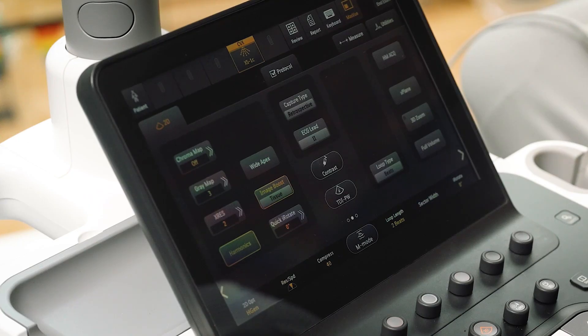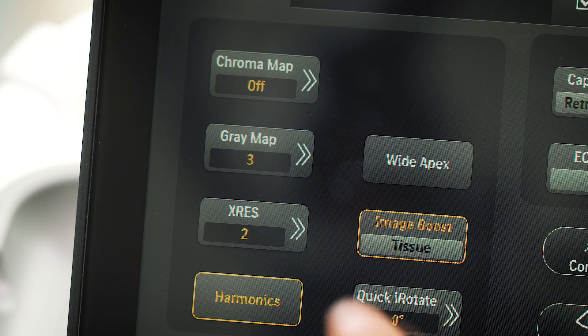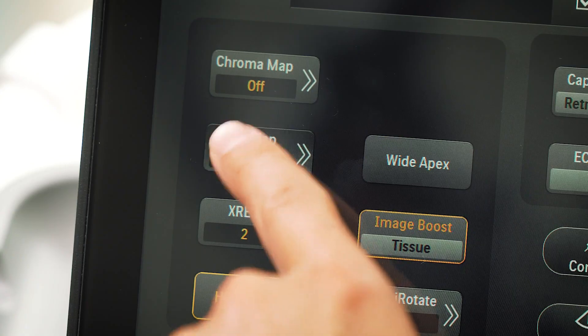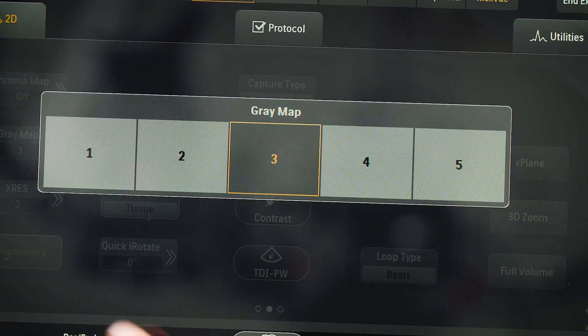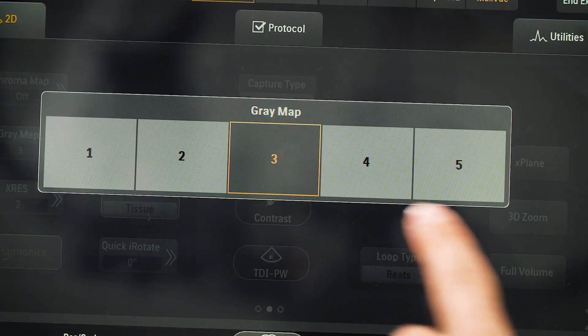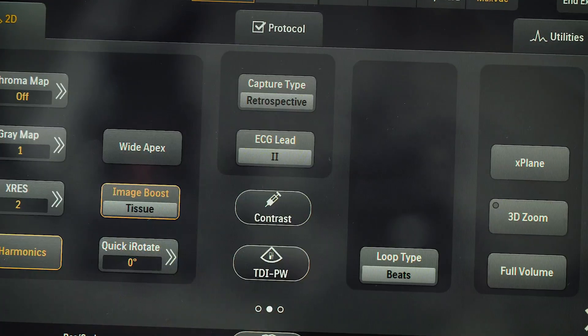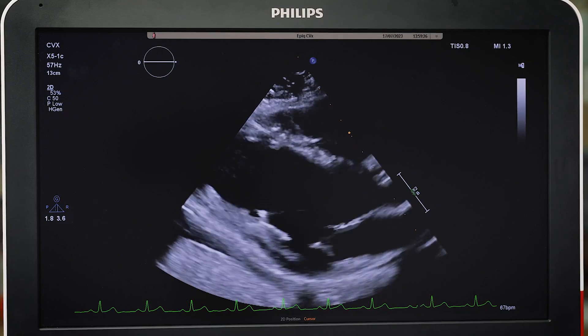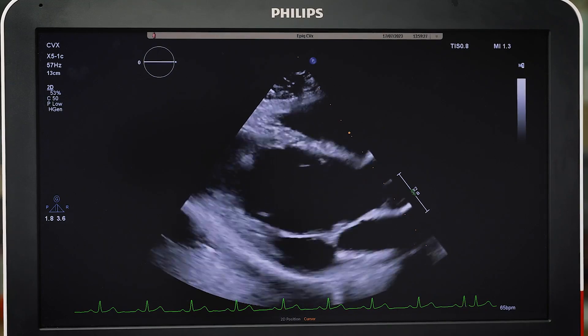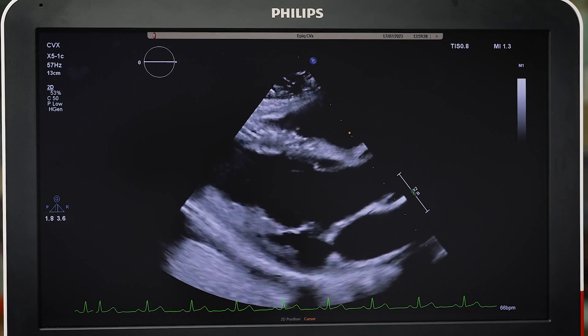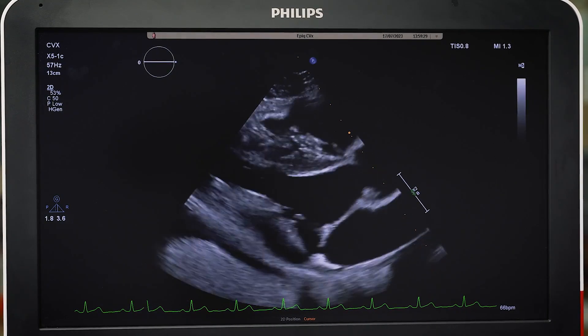Grey maps further adjust the levels of grey within the image. There are 5 grey maps, with 1 having the least grey fill and 5 the most. Grey maps can be optimized for user preference.